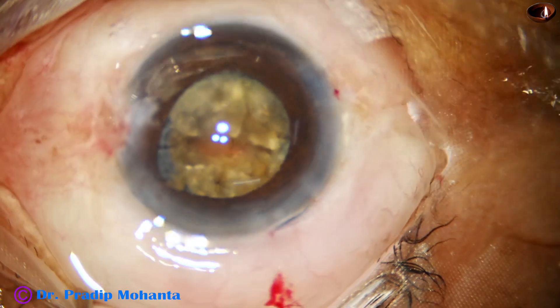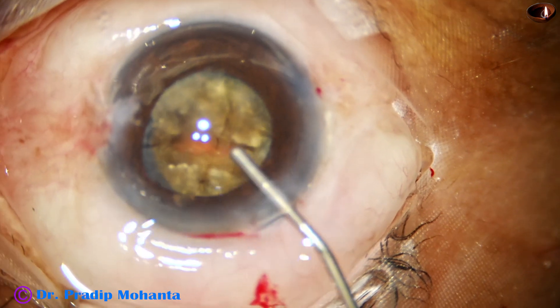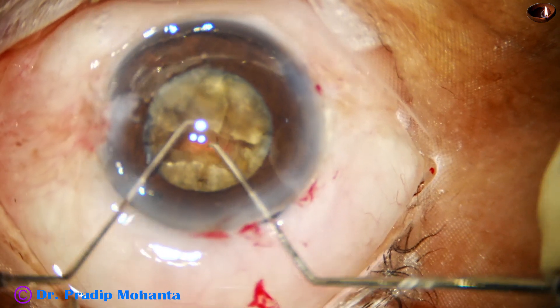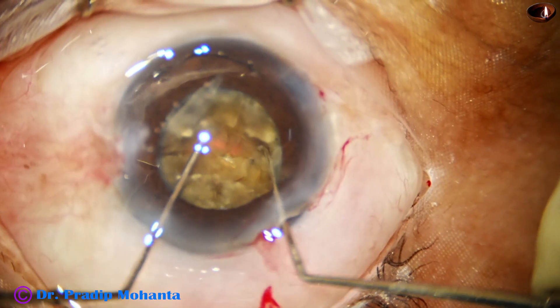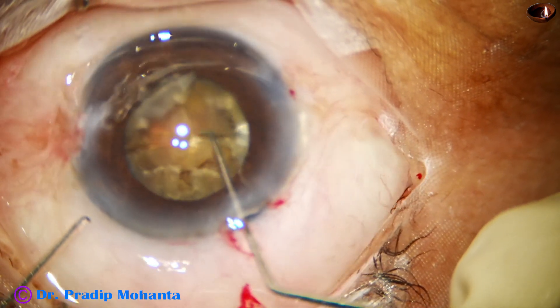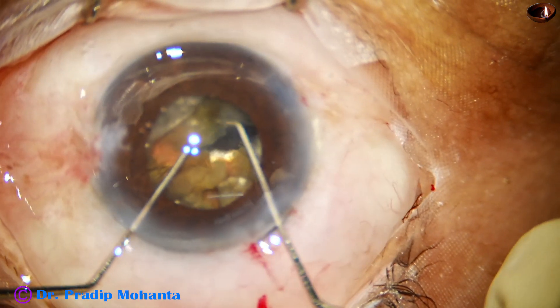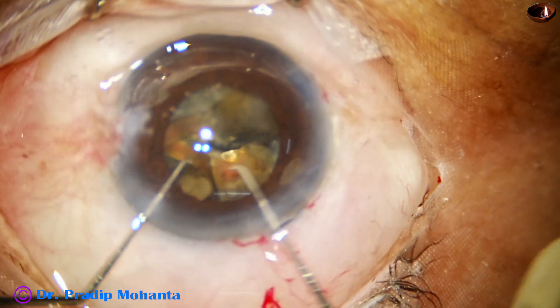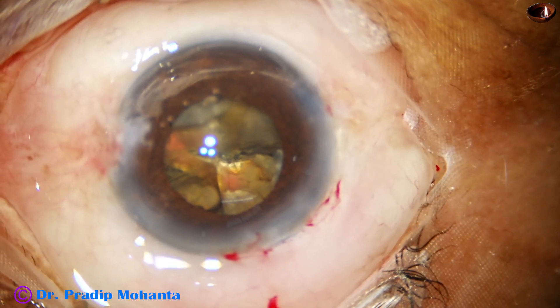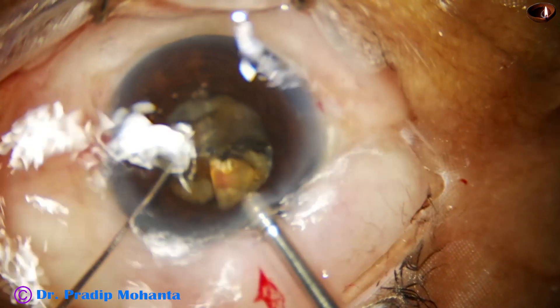You have to have patience. You have to give time, do surgery slow, use visco again and again to protect the corneal endothelium — particularly when the patient is one-eyed, you have more apprehension in your heart. Now I lift the hemi-nucleus, get one free nucleus, and then the other one. Now I have got three free nuclear fragments, and I use visco to fill up the AC before going back into the anterior chamber.